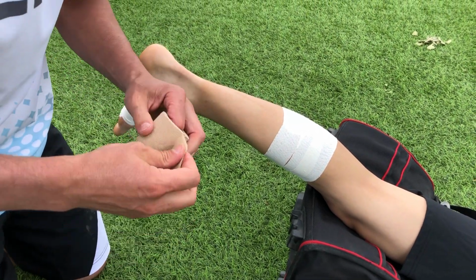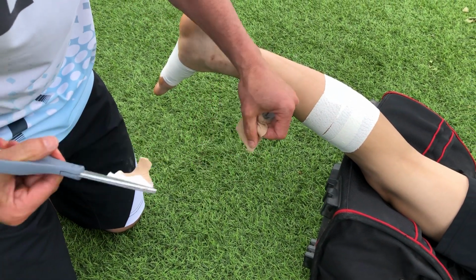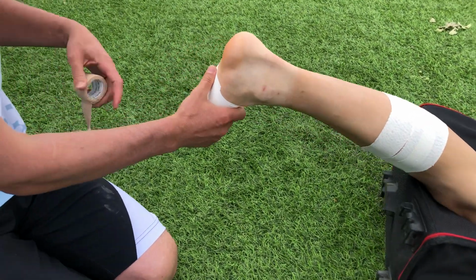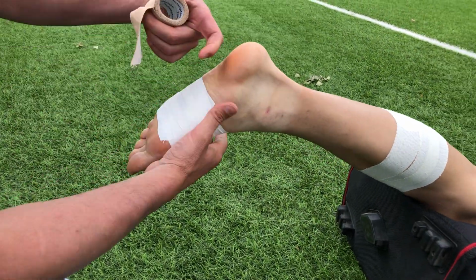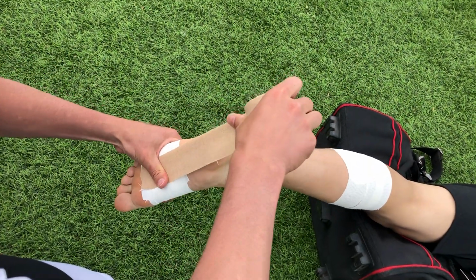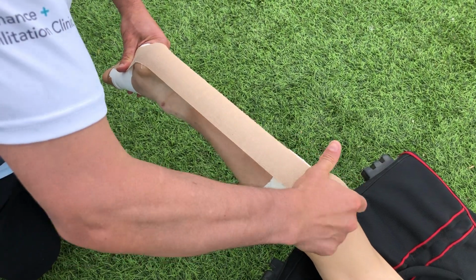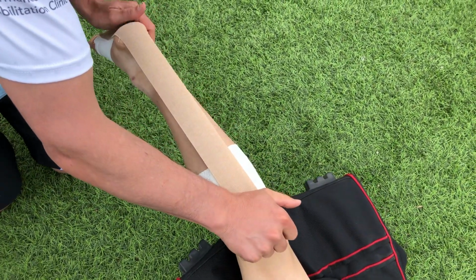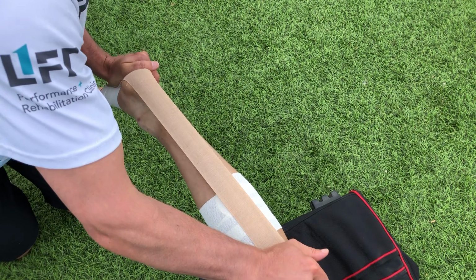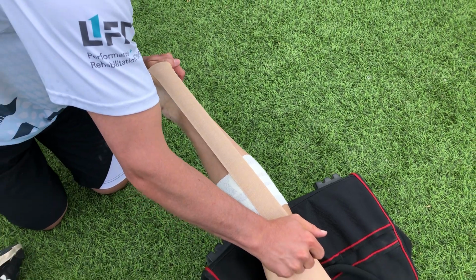Now we're going to use tensoplast to create our more functional tape strips. We want to be relaxed here. We want to be plantar flexed as we apply this tape job, and that way we can set some appropriate level of tension. This is a stretchy but not too stretchy type of tape. As we're applying it, we can see how much he's going to be able to move given how much tension we're putting in. When we get to 90 degrees, we've got a fair bit of tension on this, and that's where we want to be.